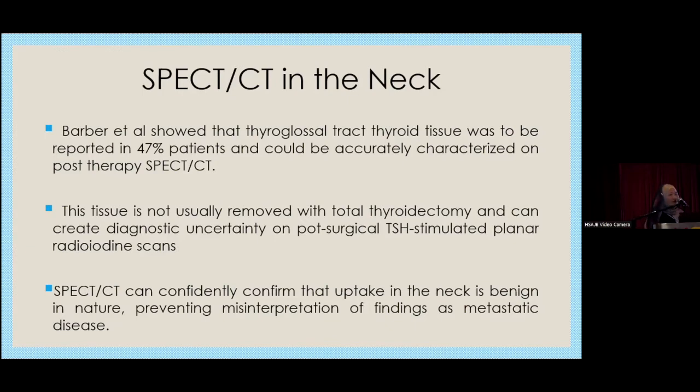I think we really have a bad experience regarding this. Even in thyrotoxicosis patients, you can really have a persistent uptake of the thyroglossal cyst, more so in a patient who had total thyroidectomy. And if you keep on giving radioiodine, it is actually meant for a benign disease, which I think SPECT-CT really helps in differentiating the diagnosis.